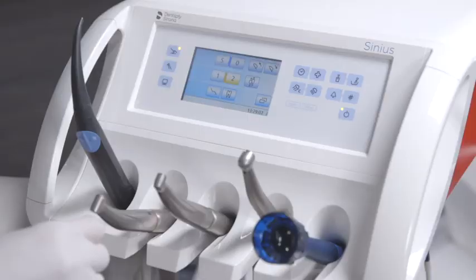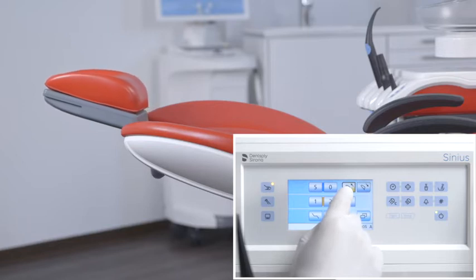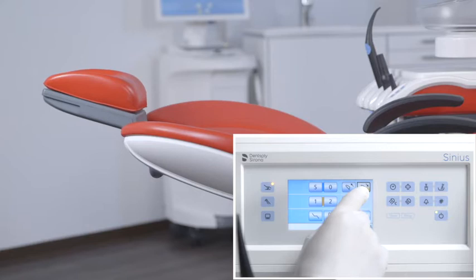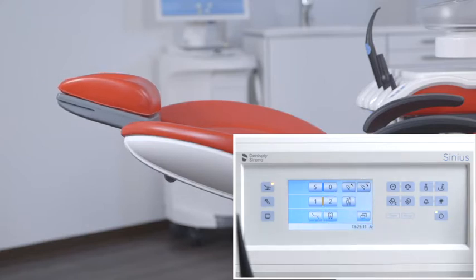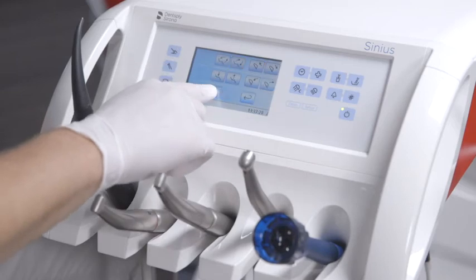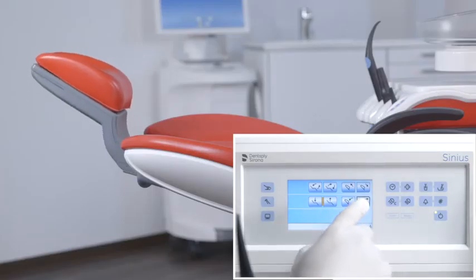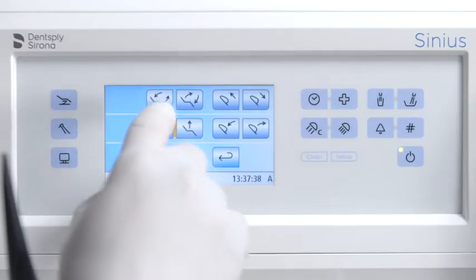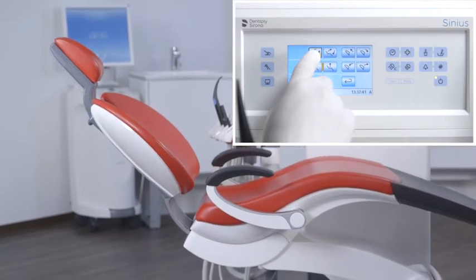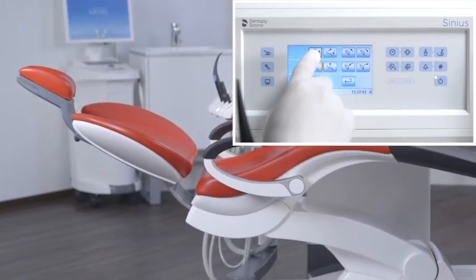With the Move Headrest In and Move Headrest Out buttons, the headrest is moved to the correct height. With the headrest buttons in the subscreen, the headrest can also be tilted or extended. Ergo Motion can achieve compensated motion of the seat and backrest without any compression or stretching effects for the back.